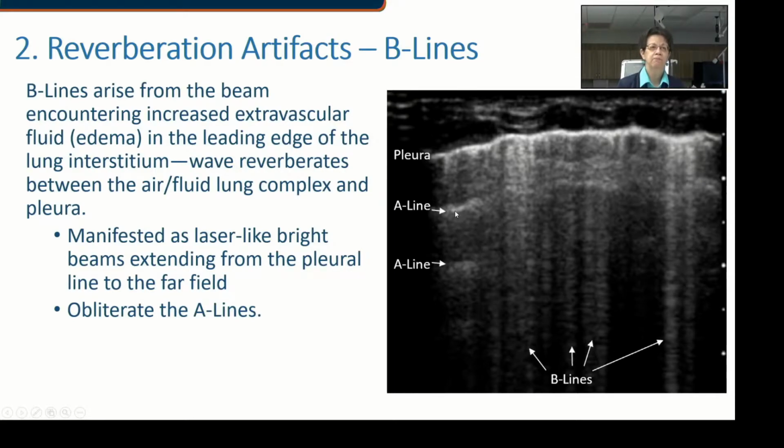But like I said, a few of these you're going to see, and it's not uncommon to see them. It's only when we see many of them that we begin to have some concern that there's edema of significance in the lungs. And where this can become important clinically is it can determine whether or not you're going to hydrate this patient or not, because that may have an impact on your clinical decision.